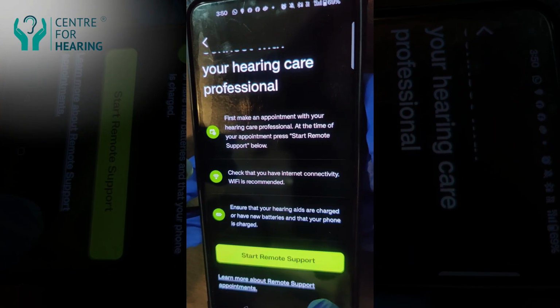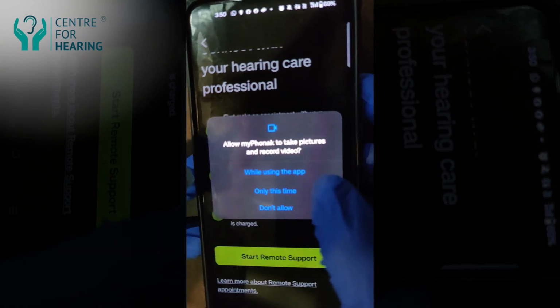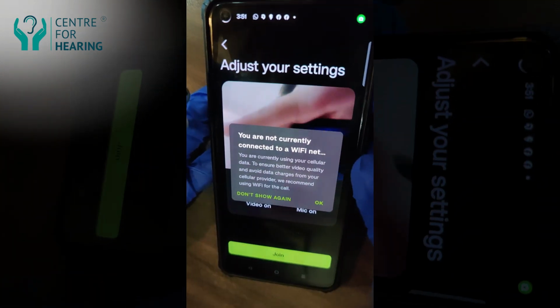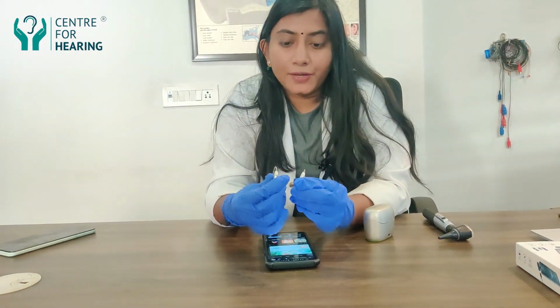It will give you an option called start remote support. At the same time, you have to take an appointment from your hearing care professional. Just give access to your microphone. Finally, we are starting a remote session. This is how the Phonak application works.